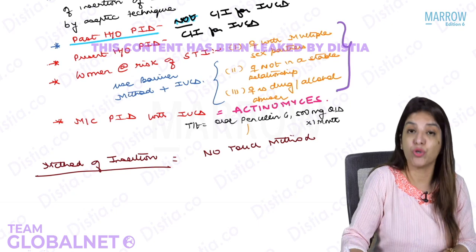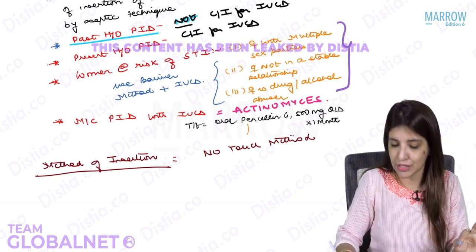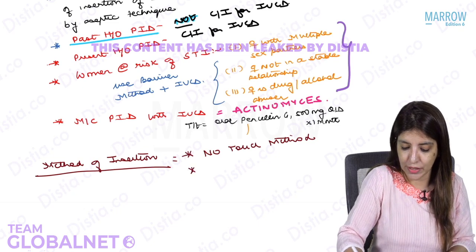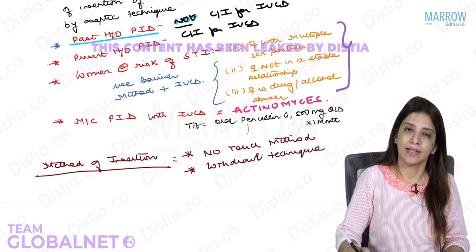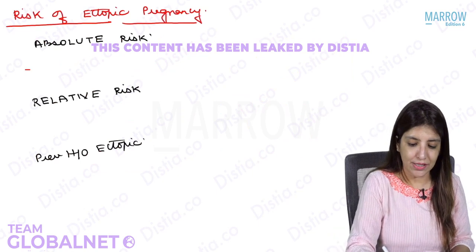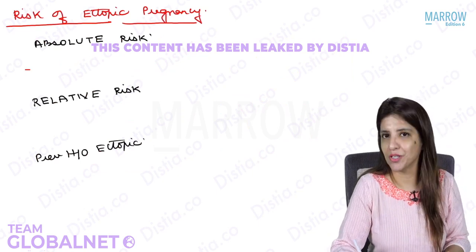And just now I'll show you how to load an IUCD without touching it, right? And a withdrawal technique. Withdrawal technique. Clear?